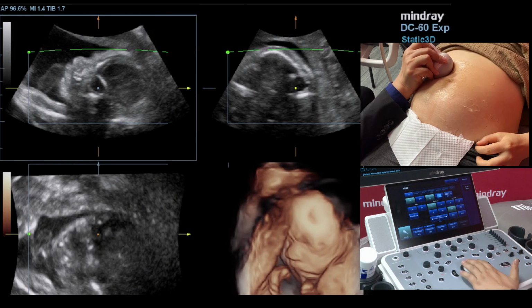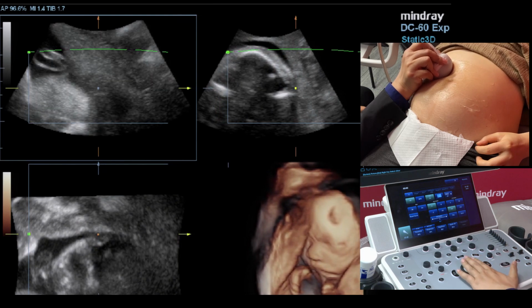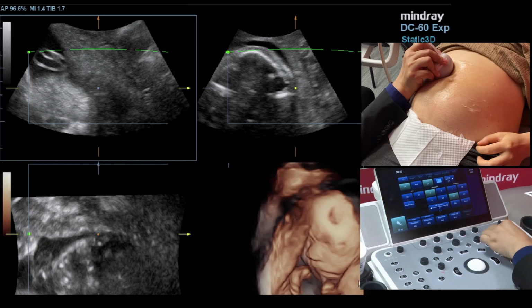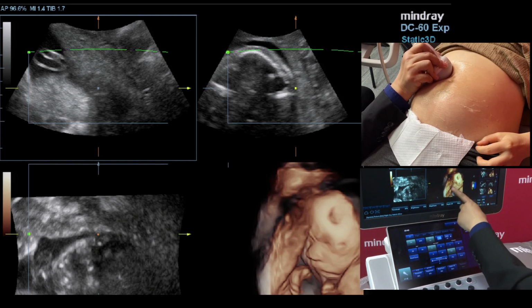First, I will change this button just to shift the image. Then put something here that you're interested in the middle of the line. You can see the A plane and C plane. You can see here it's maybe the placenta or the wall of the uterus.